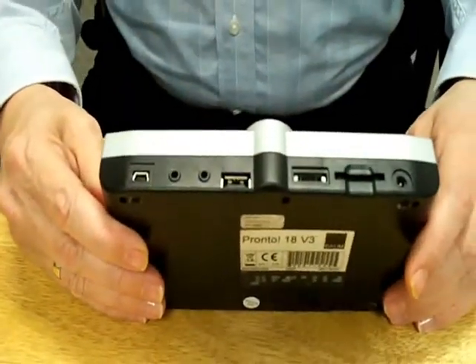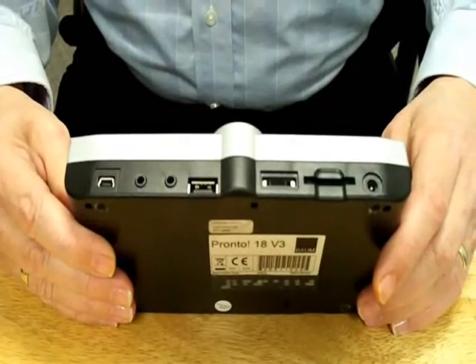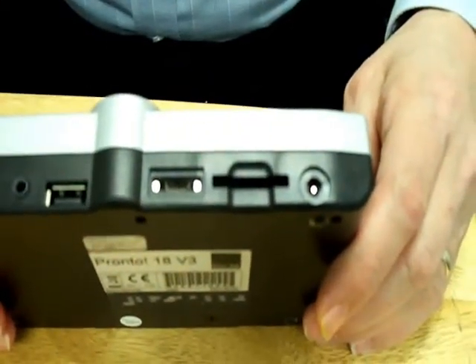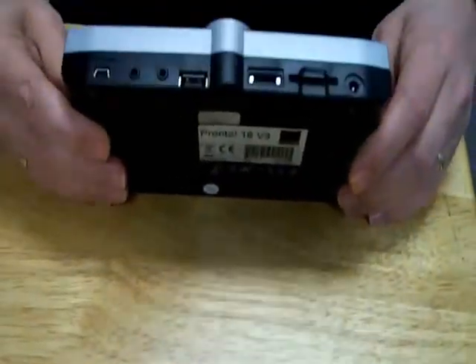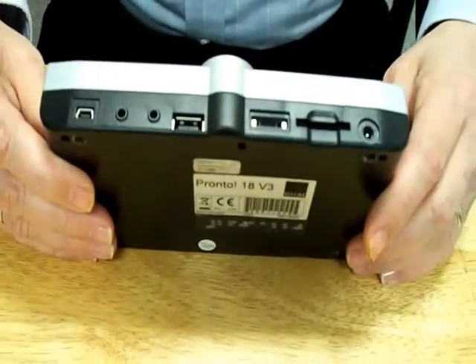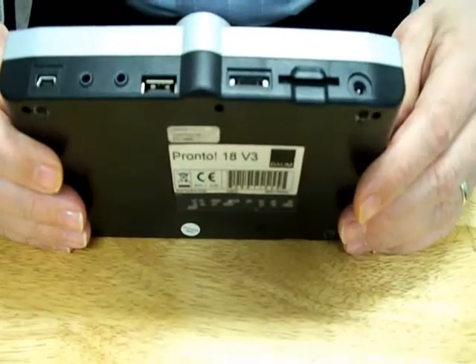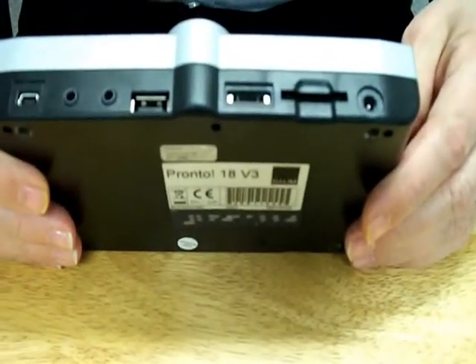We'll go from left to right, and the first item on the left is where you plug in the power adapter. As you heard, Pronto has a 10 to 12 hour battery life, and that really is true. I can use Pronto for 2, even 3 days without having to recharge it. So that's a good feature. Next to the AC adapter plug-in is a serial port.